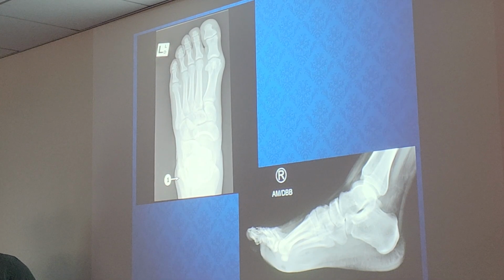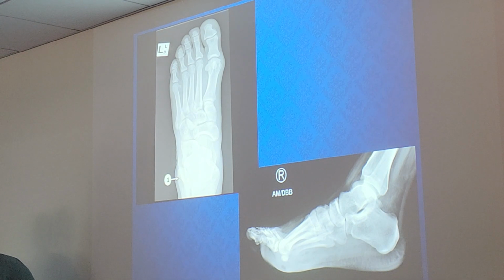What projection is that right foot? The lateral? Okay, my question is specifically, yes, medial lateral. Why is it medial lateral? I didn't understand what the question is. So my question was on this lateral foot X-ray, I know it's a lateral foot, but what is the specific projection? When we talk about projection, what are we talking about? How the X-ray travels. The direction of the central ray, right? So it's medial lateral because why?